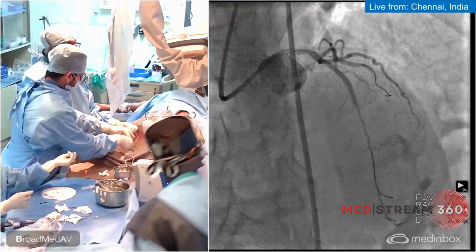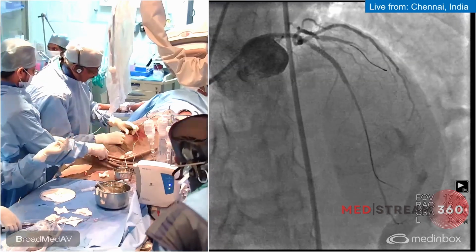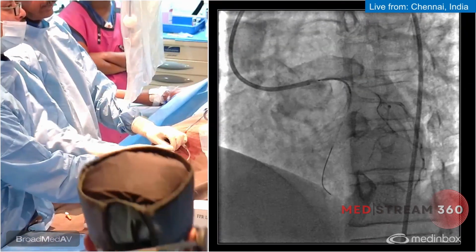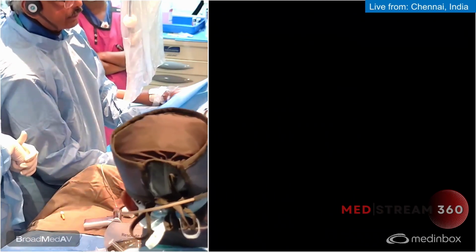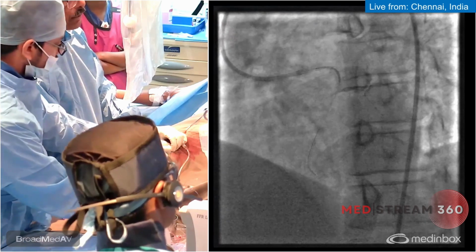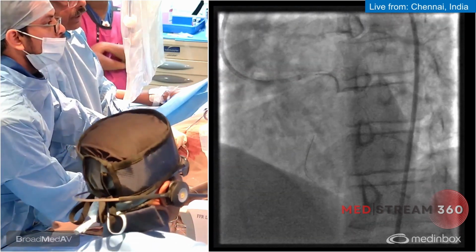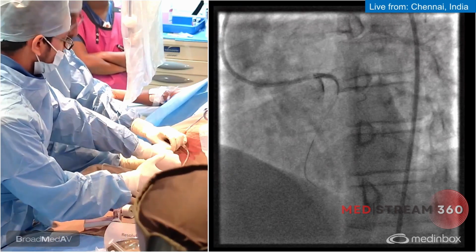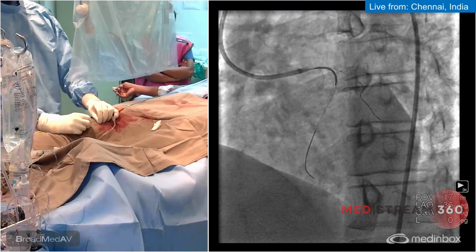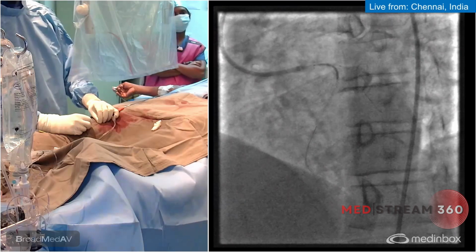So now we're going with a 30. We'll fix the overlap in the left main ostium. Maybe retrospectively looking, 26 could be enough, but I think it's okay. We can accept an additional 2-3 millimeter overlap. It looks a bit outside, so we're going to go in a bit. Small check, please. Yeah, this. And that looks nice. Take one cine and then deploy the stent. And we will target the lower border of the left main rather than the upper. We're targeting the lower border and going up, please. Yeah, go ahead.